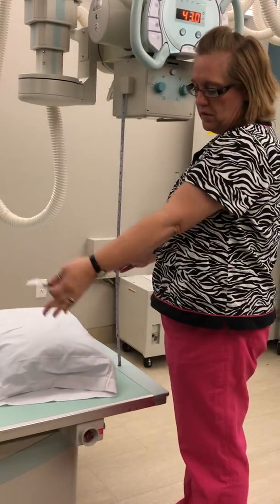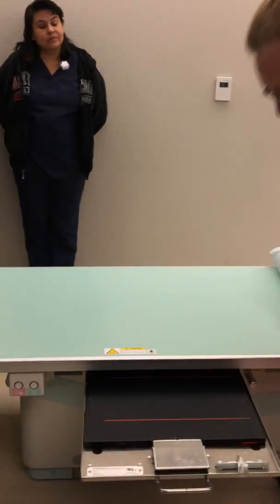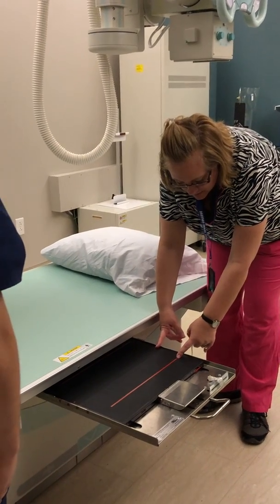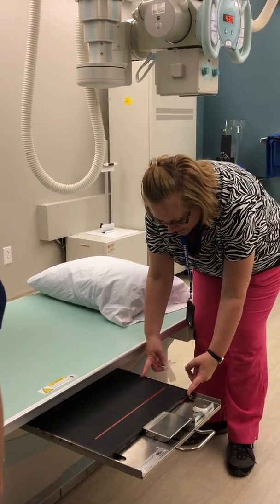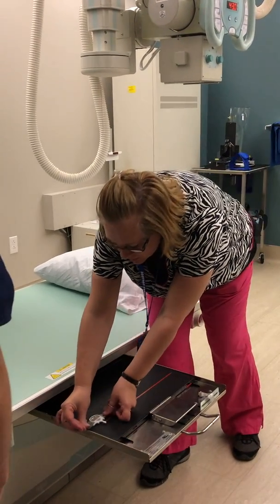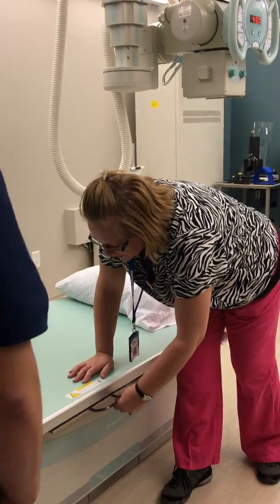Inches to the IR. So the 46 here plus the 2 inches to the IR would give me the 48 that's recommended. When you are placing your marker, if you place it actually on the IR itself, consider that you're going to be collimating, and this particular IR has the line that shows you where the midpoint is from here to here. But if it doesn't, just put your fingers at the edge and the midpoint and then cut that in half, and that's where you want your marker placement to be. I prefer it on the lower edge, but the upper would probably be okay too.